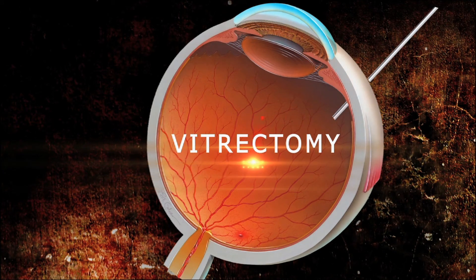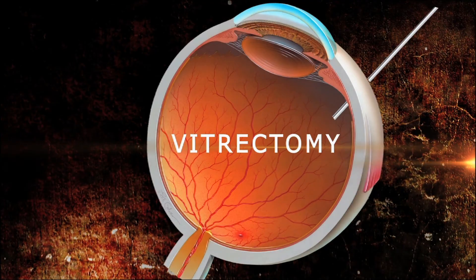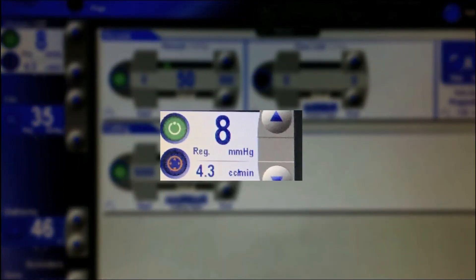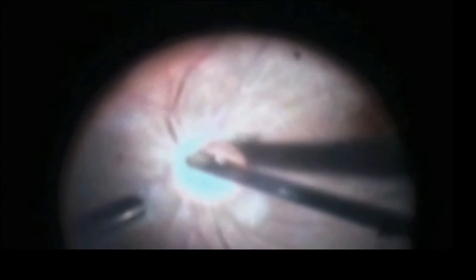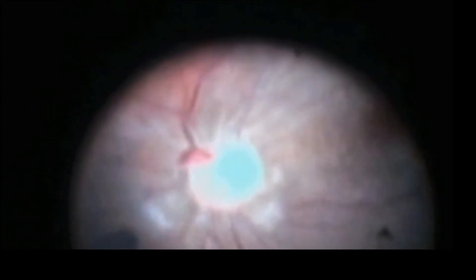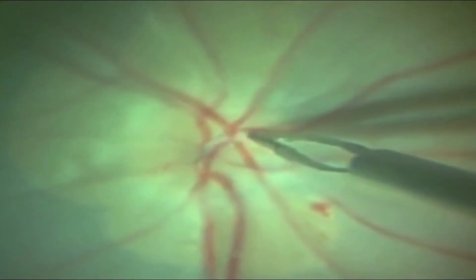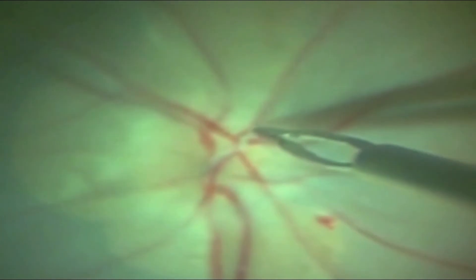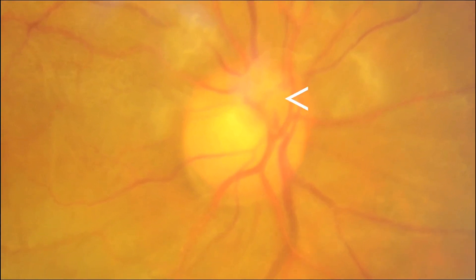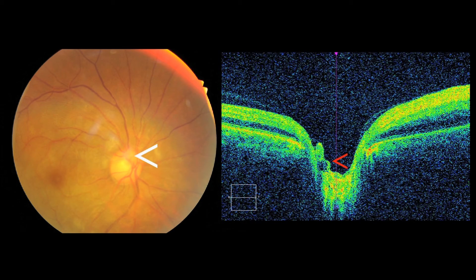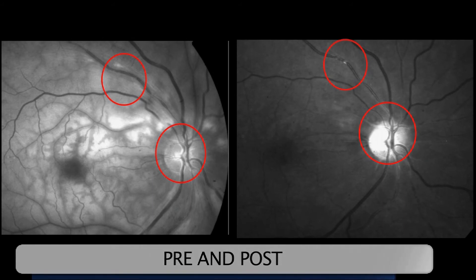Conceptually, we can achieve many goals by performing a vitrectomy as a treatment for CRAO. By performing a low IOP vitrectomy, we can achieve long-term hypotony not only intraoperatively but also post-operatively if we leave the eye hypotonous at the end of surgery. Massaging the central retinal artery can also help dislodge an embolus if present. If necessary, the central retinal artery can be nicked to remove the embolus. We perform disc dissection by opening the central meniscus of Kuhnt, which is continuous with the peripapillary internal limiting membrane, and an arterial sheathotomy to aid the dislodgement of the embolus. Sometimes we find an abnormal glial tissue over the optic disc, and removal of this tissue does restore ocular perfusion.